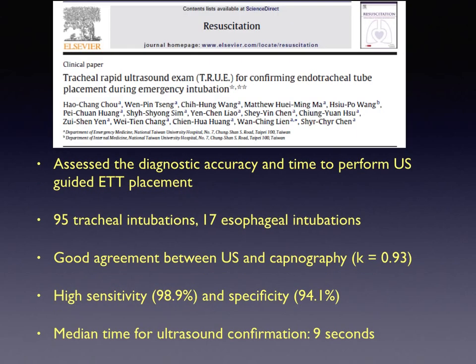A recent study from Taiwan called the TRUE study, TRUE being an acronym for Tracheal Rapid Ultrasound Exam, was designed to assess the diagnostic accuracy and timeliness of ultrasound-guided endotracheal tube placement during emergency intubations. The sensitivity and specificity were similar to Werner's study in correctly determining endotracheal and esophageal tube placement by ultrasound.